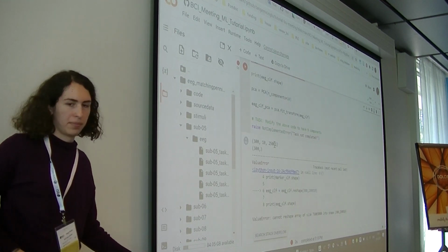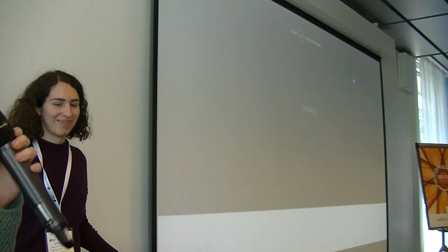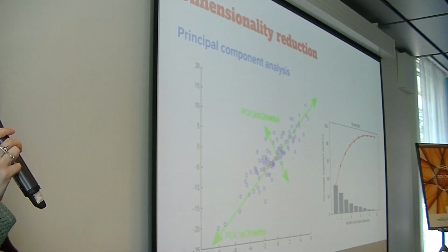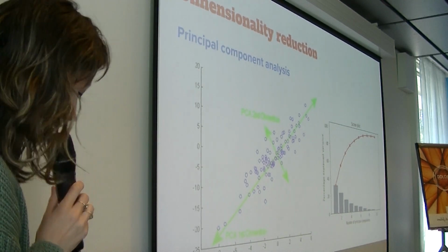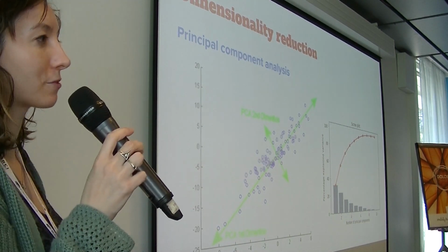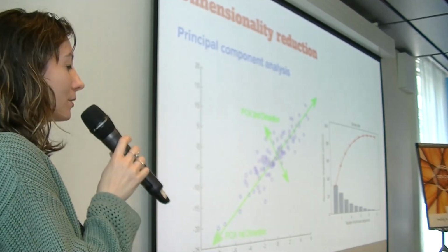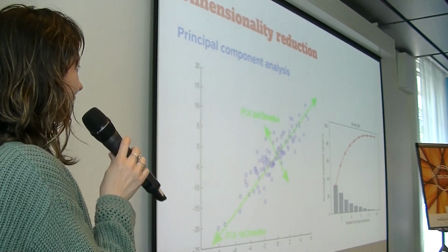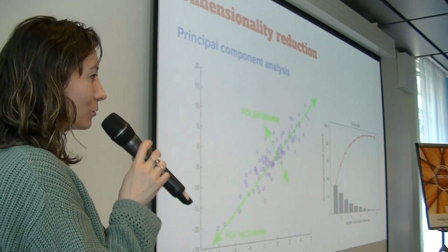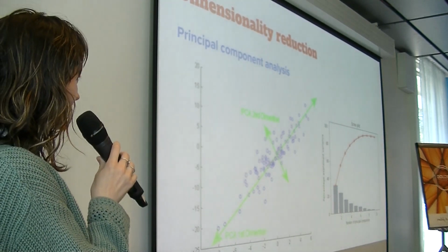Yeah, I'm not sure if you can technically call it ML, but what we want to start out with is a very simple transformation on the data. Something called dimensionality reduction is a very common type of transformation in EEG data or any other kind of brain data, because you typically end up with lots of data points or lots of channels, and we want to reduce that amount to something that's more handy to work with.